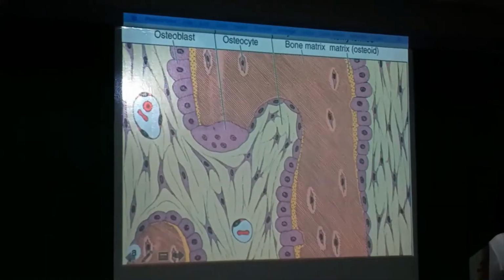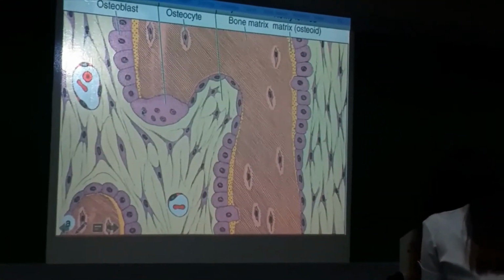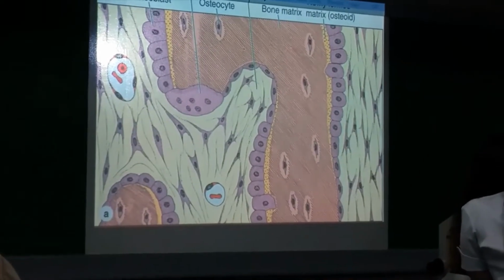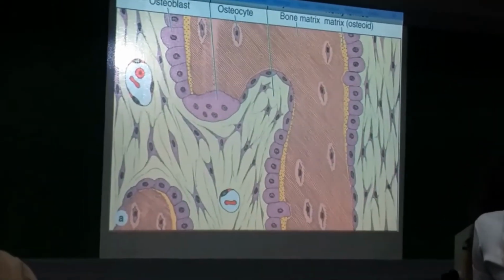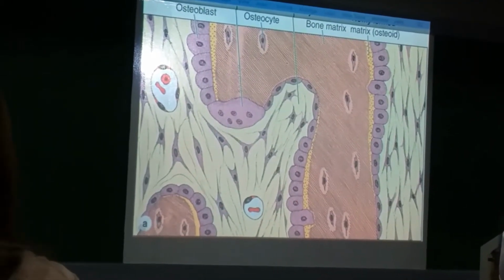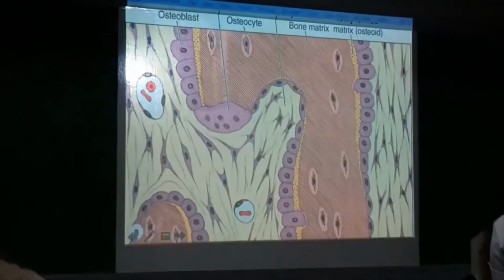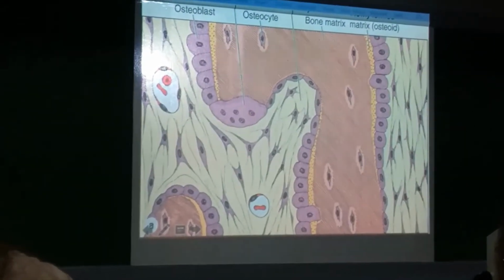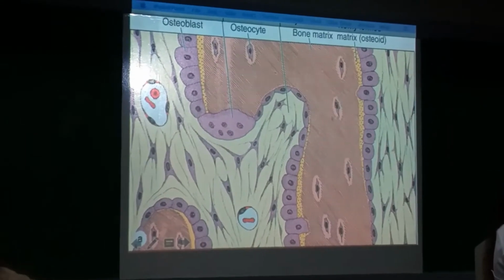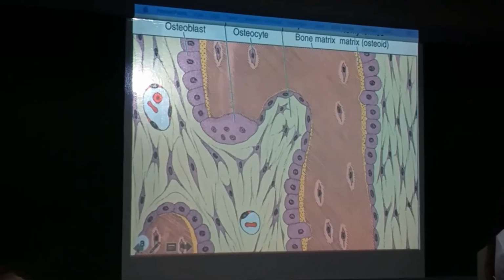Okay, what is the function of the cell pointed? Your osteoclast, its function is bone resorption. Okay, again, function is bone resorption. Okay, you've encountered your mesenchymal cell, right? So in the screen, these are your mesenchymal cells. These will become osteoblast or osteocyte later on. They are only at the periphery.